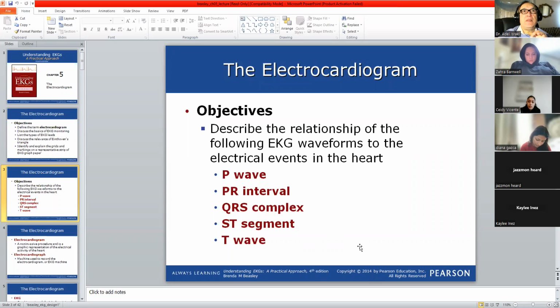And the ST segment, like we practiced, we note that it is on the isoelectric line. If it is elevated or depressed, meaning above or below the isoelectric line, by more than 1.5 small boxes, it means myocardial infarction or ventricular trouble. So these are 5 items. We are going to talk about them, and each one has great importance. We will spend much time on the P wave. As I told you, it is a small wave, but there is a lot of talk about this P wave and how it causes trouble for us.